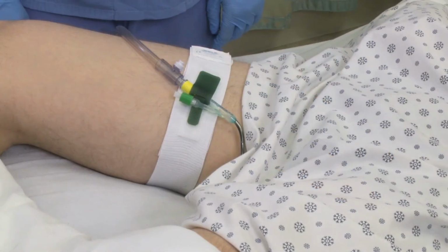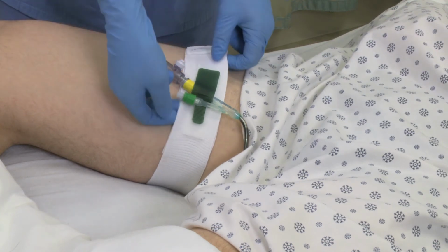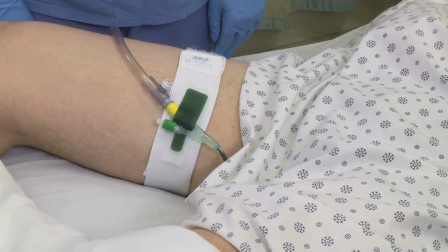To help prevent meatal irritation, the leg band can be rotated in either direction. The holder may be moved periodically from leg to leg to further reduce meatal irritation.